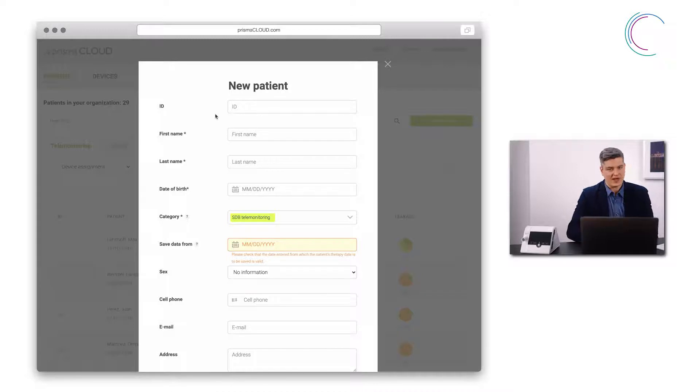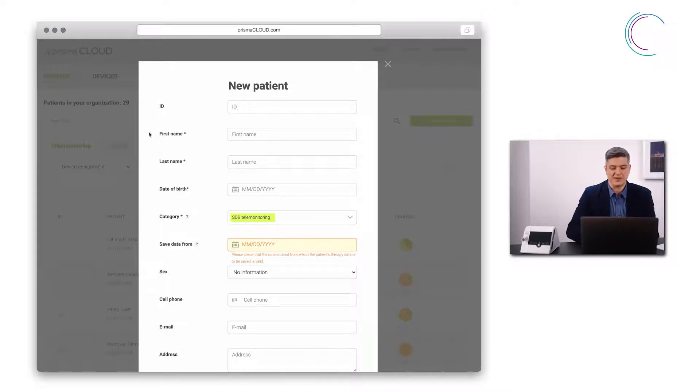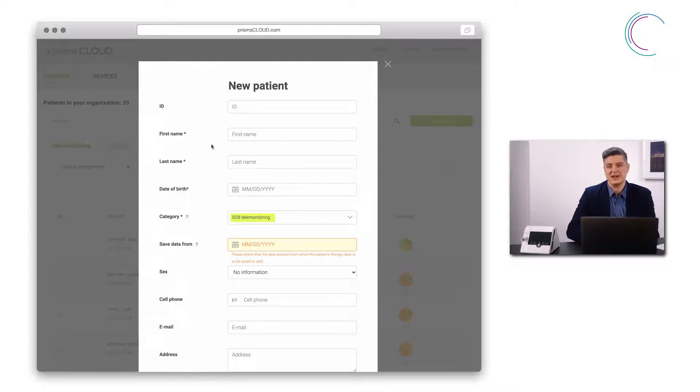It now asks me to enter the details of the patient. All fields marked with this little star here are mandatory, everything else is optional.